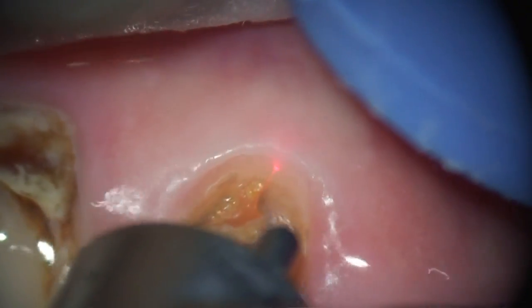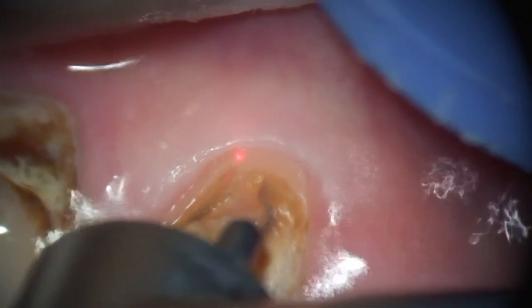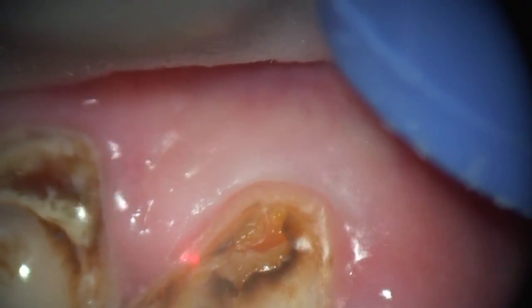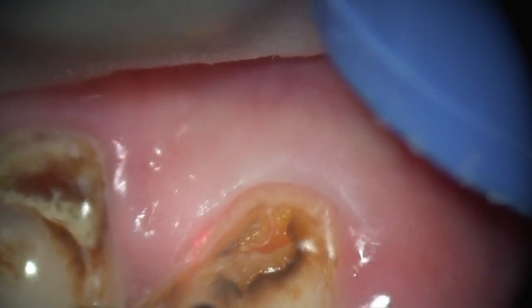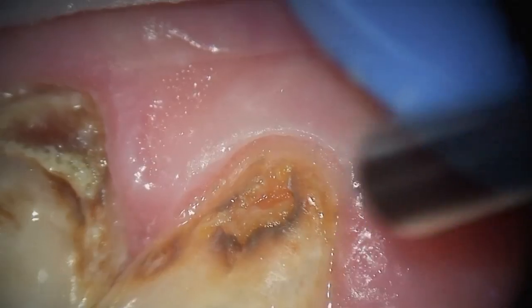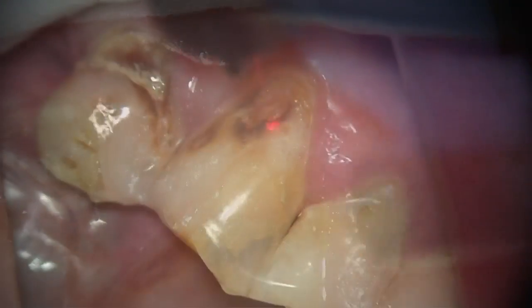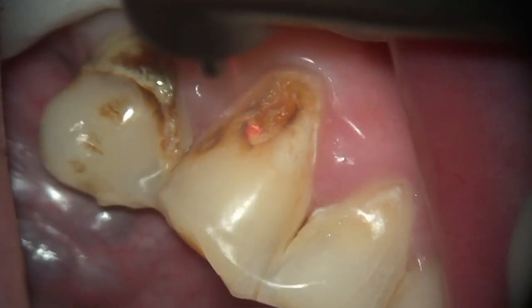You can see I'm doing a gingivoplasty/gingivectomy to create an area where I can work. I hardly ever use a topical or a local anesthetic when I'm performing these procedures — you just don't need to with the 1000 microsecond pulse duration. You can see I have a nice heme-free field.